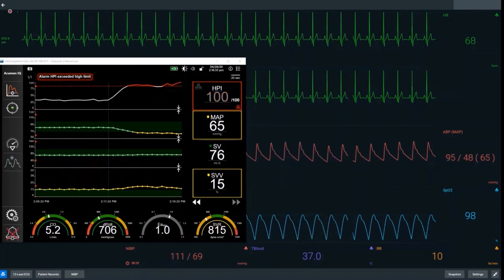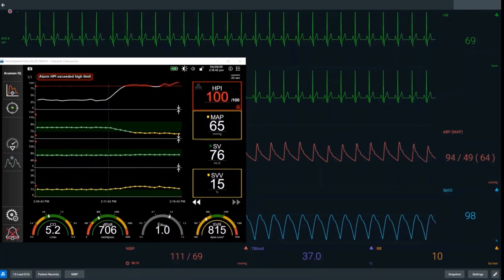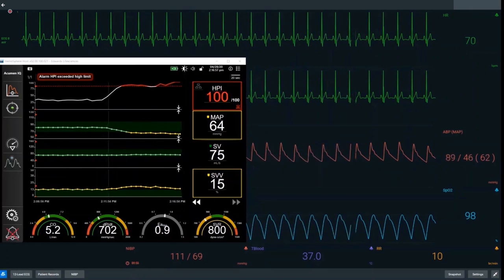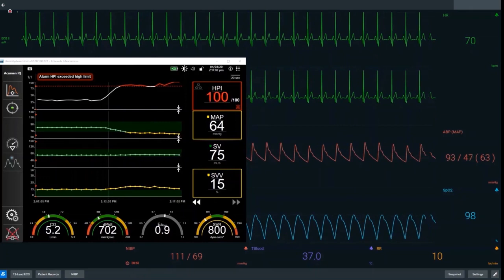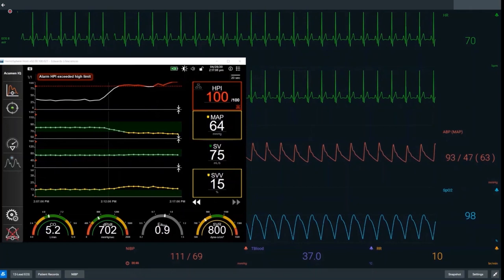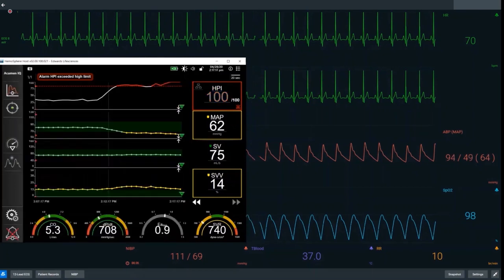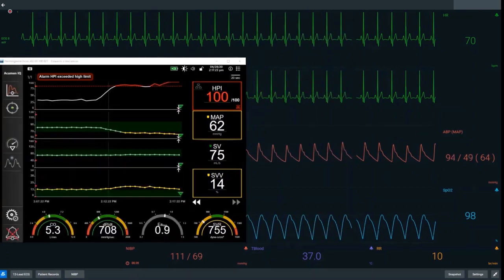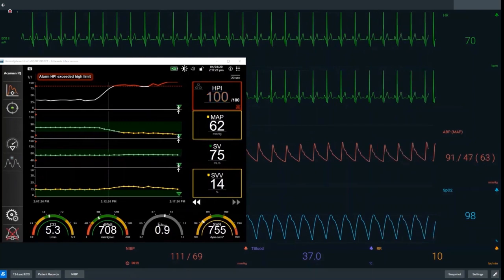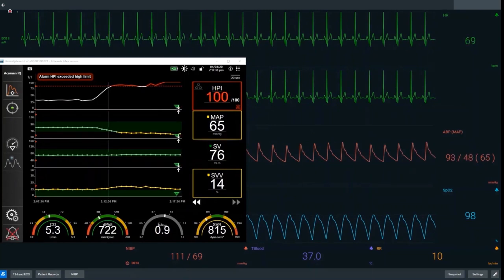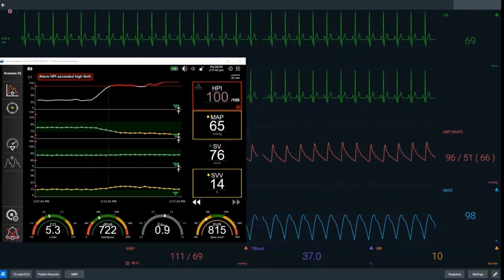It is also reasonable to give fluid to improve flow because the patient is preload responsive due to the raised SVV, but we must be mindful that this will not solve the blood pressure issue because EADYN is below the critical value. HPI has now been raised for approximately four minutes and we can see we're only just becoming hypotensive, demonstrating the prediction of impending hypotensive events. We have now given a bolus of vasoconstrictor to rectify our MAP.